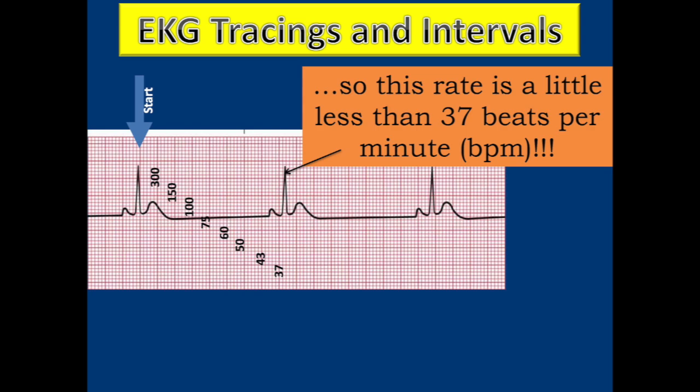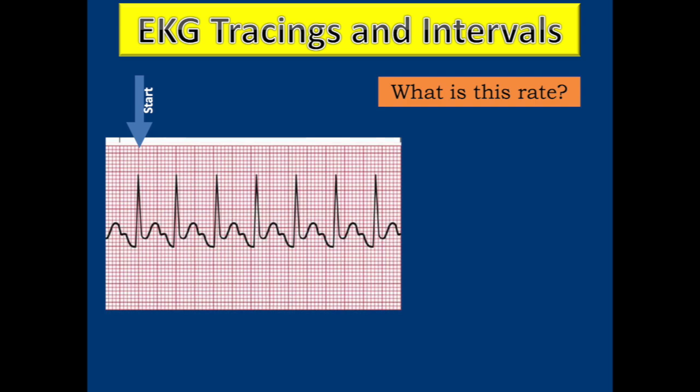It's just a really neat way to be able to quickly figure that out. The old way would have been to take calipers, find the distance between the QRSs, and then do some multiplication, knowing how big those big squares and the little tiny squares are, and the amount of time that they take.